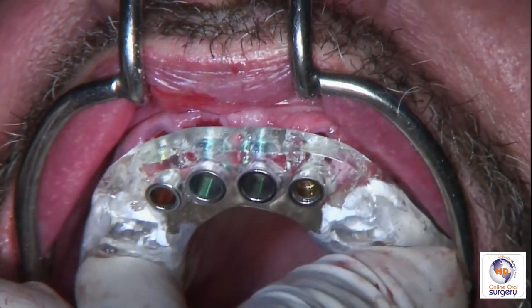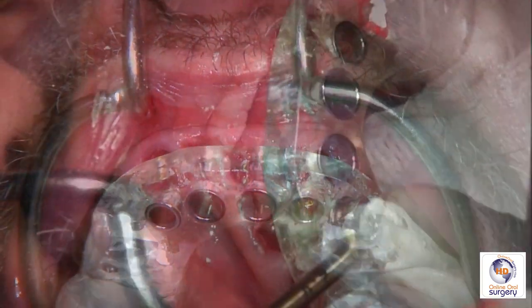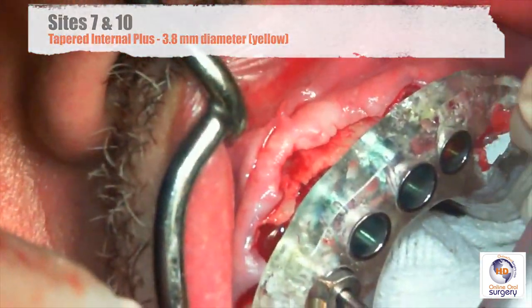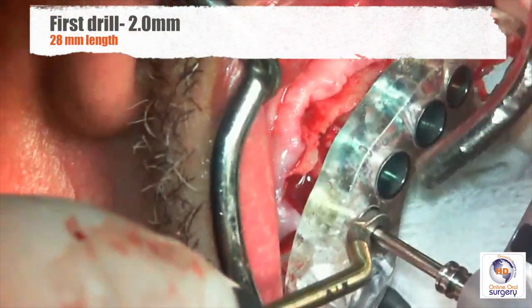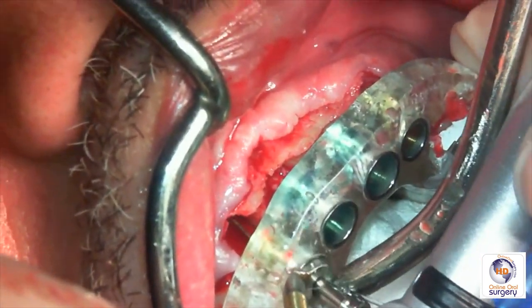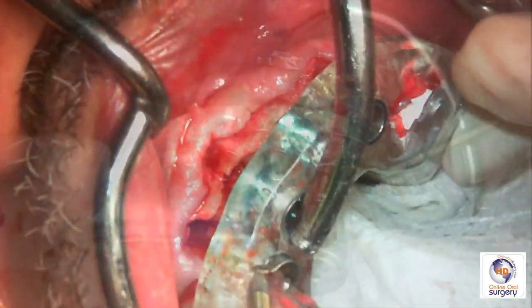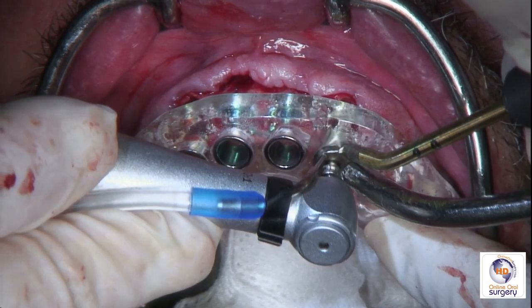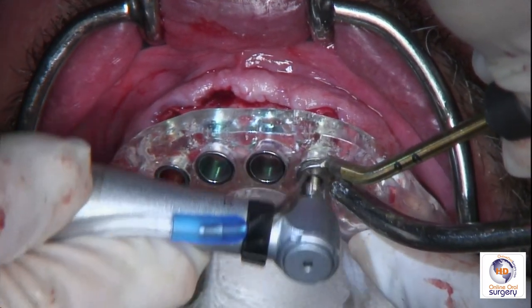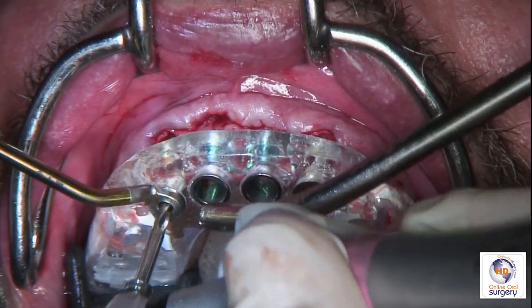the implant. So we're going to place our surgical guide in place. This has been created from our electronic digital treatment plan. We're going to start with our 7 and 10 implant osteotomy sites with a 2.0 twist drill. We're going to go to 28 millimeters in depth as per our recipe or drilling protocol. And we're going to go all the way to the depth, all the way to that stop, using lots of irrigation, light pressure, and short strokes in order to get lots of irrigation in and get the bone debris out.